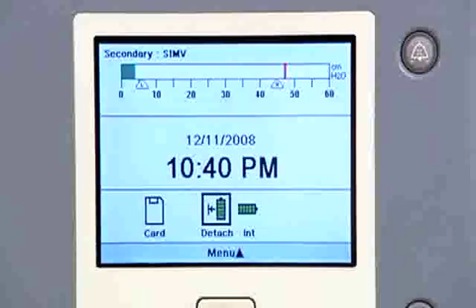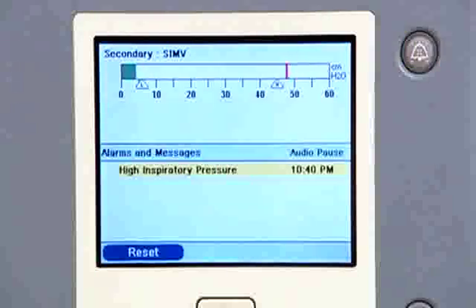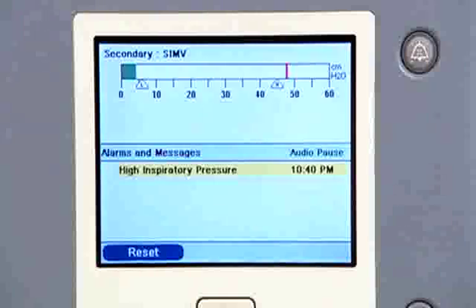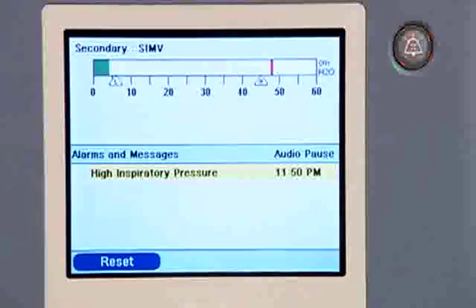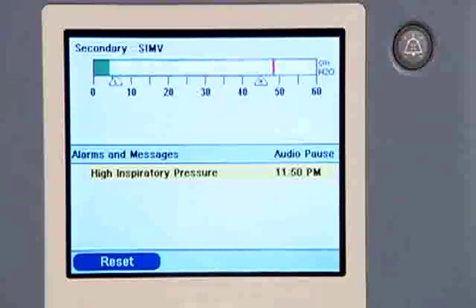This is a medium priority alarm. You hear three beeps in a repeating pattern and the audio pause button flashes yellow. Medium priority alarms require prompt attention. You can silence the alarm for a minute by pressing the audio pause button. An alarm message will appear on the display screen, highlighted in yellow.